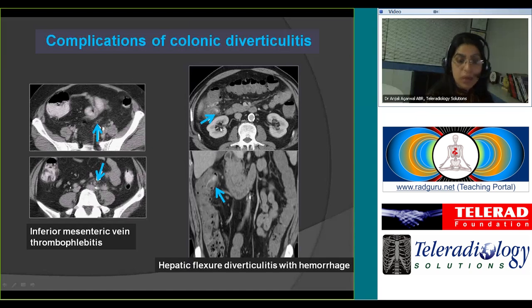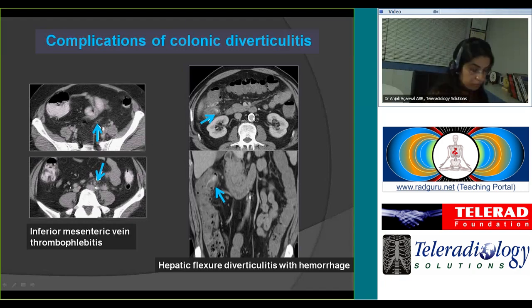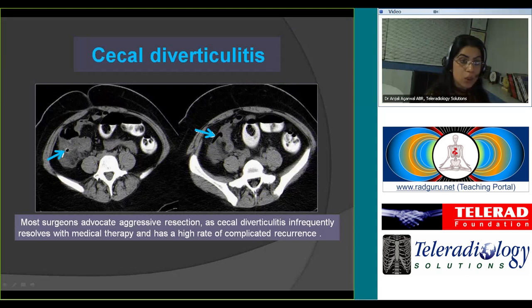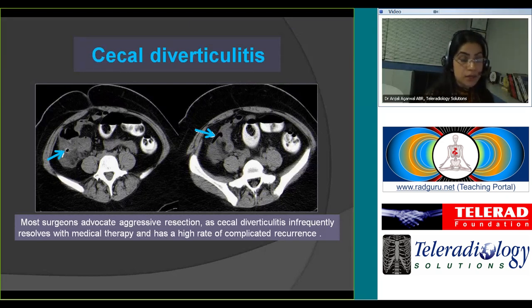Hemorrhage can also be a complication of colonic diverticulosis or diverticulitis. In this case, a diverticulum at the hepatic flexure is inflamed and there is ill-defined contrast within the colon indicating active hemorrhage — no oral or rectal contrast was given, and this density is similar to contrast in the aorta. Example of cecal diverticulitis: the normal appendix is identified, and the right lower quadrant pain is explained by the inflamed cecal diverticulum. Surgeons feel aggressive resection is needed as cecal diverticulitis usually does not resolve with medical therapy.